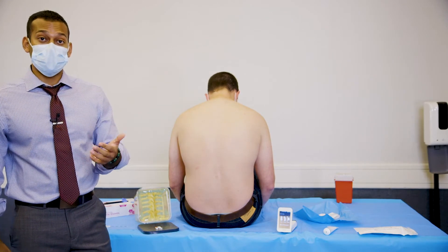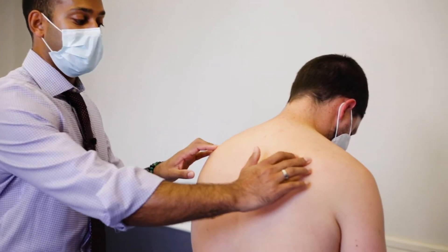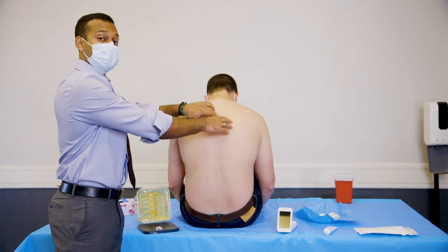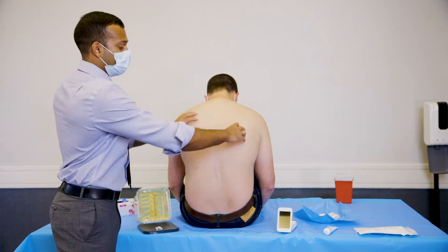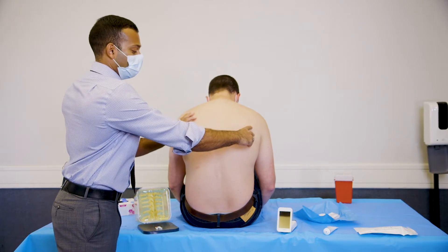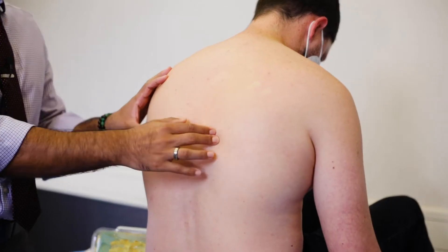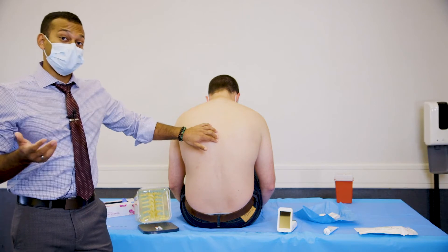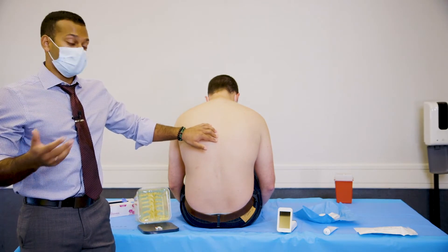The next thing you're going to do is locate the area that you want to go through. We can find the scapular spine, which will demarcate the T3 space or the T3 spinous process. You're going to go down from there and find the inferior angle of the scapula, and just midline to that is going to be your T7 vertebral body. This will allow us to find the T7-T8 interlaminar space, which is where we're going to do our procedure today.